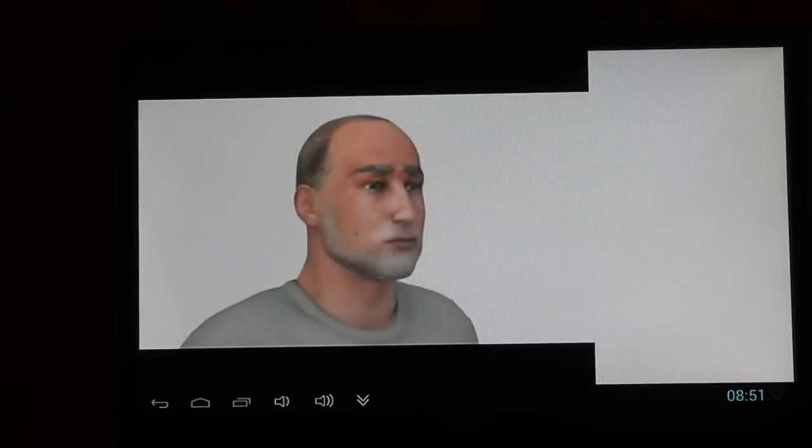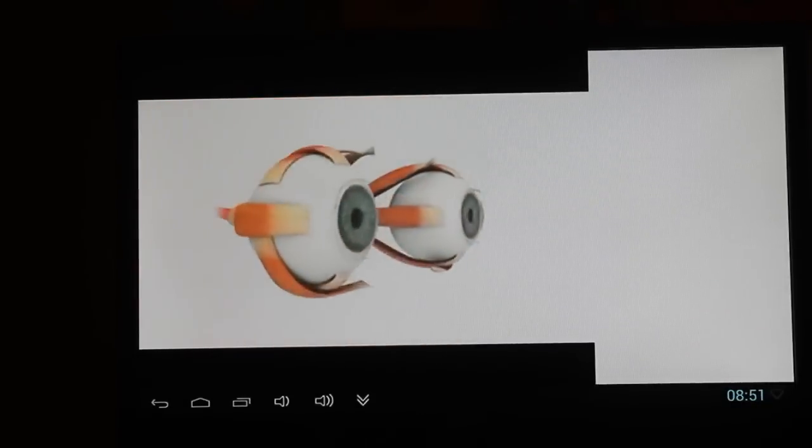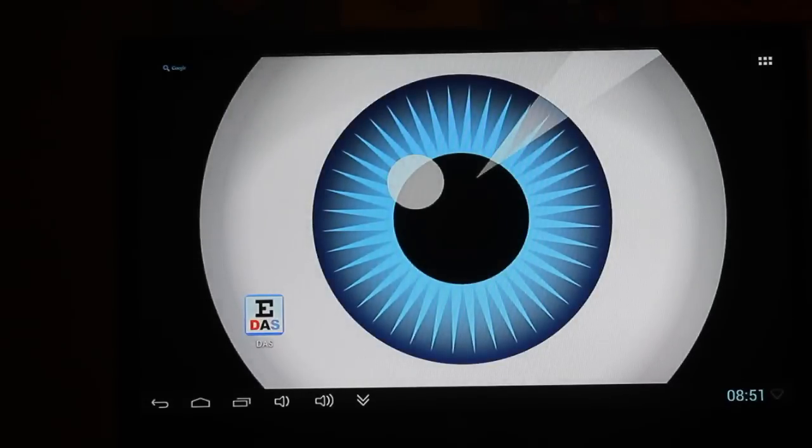This animation will show how surgery is used to correct a cataract. This operation is called phacoemulsification cataract surgery. Click the navigation arrows below the animation screen to play, pause, rewind, or fast forward the animation. To end the animation, all we do is hit the home button and then go back to the application.